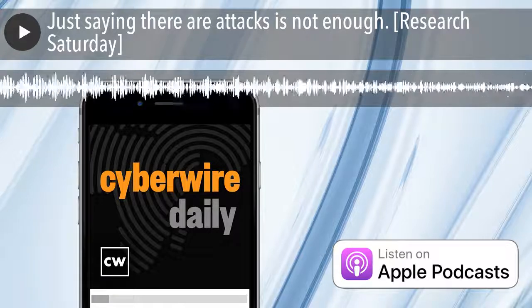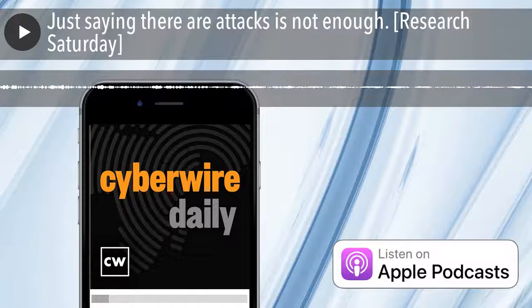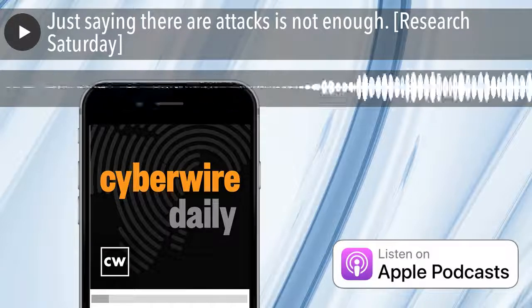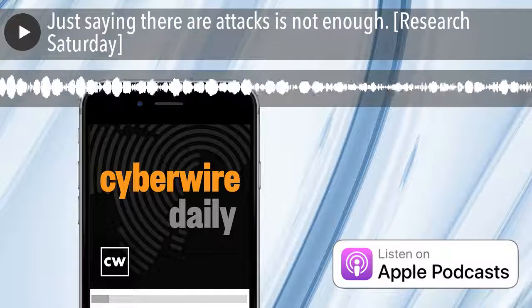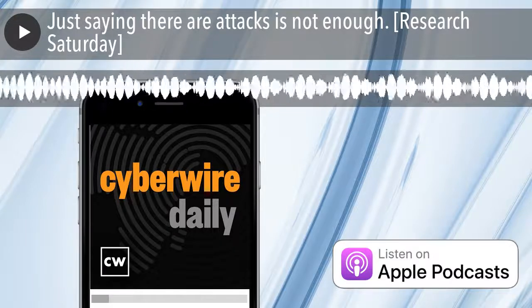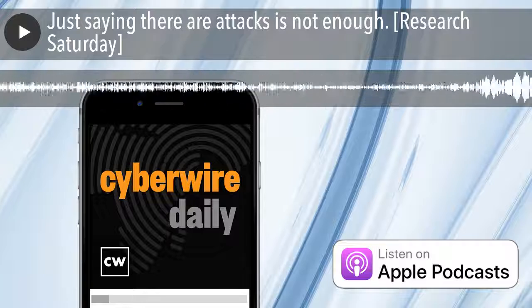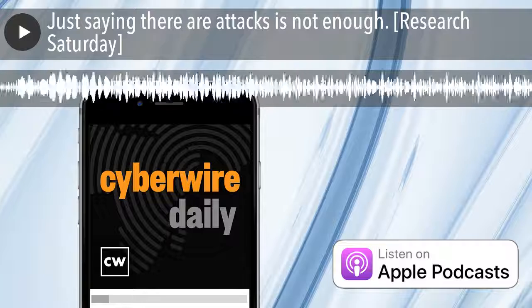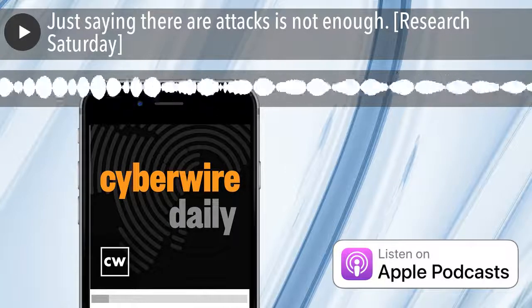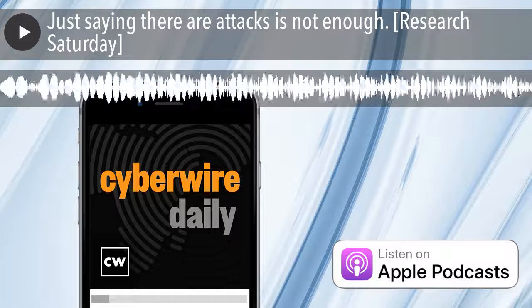So if an attacker tries to, like you asked at the beginning of the interview, take the power level, let's say, to 10, or multiply the radiation level by 100, the result of such an attack will be an instruction with too much radiation. We catch this instruction, and by using AI methods, we can learn what are normal instructions and what are anomalous instructions, and then detect these anomalous instructions.